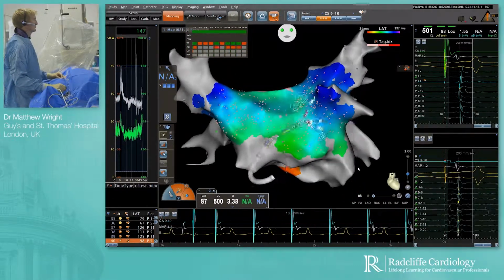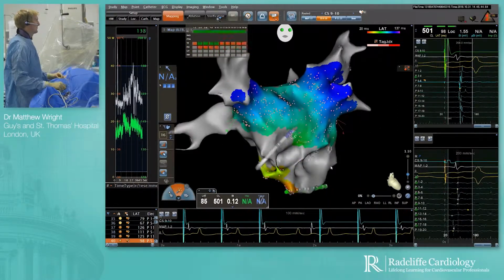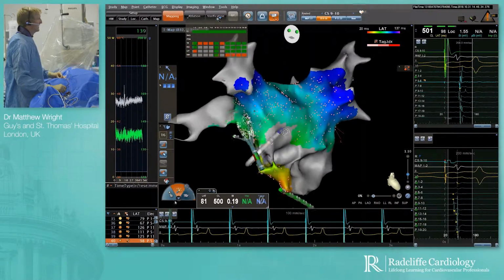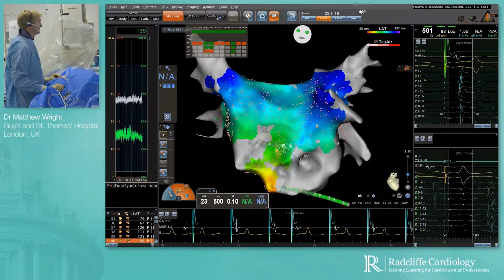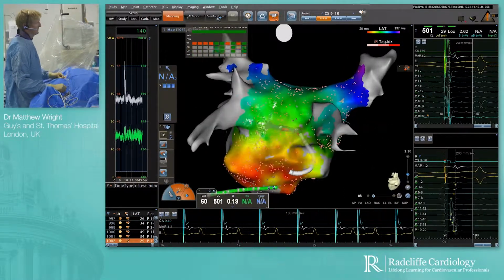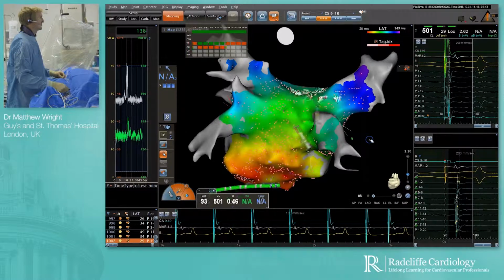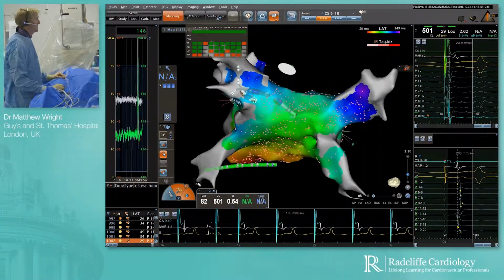we're going to work in, and also we'll have at least 1,000 individual data points within the body of the chamber of the left atrium, which is able to tell us voltage information, and therefore whether there's a lot of scar or minimal scar or no scar. Again, we can correlate this with the MRI, and unless there is a huge discrepancy, the lesion set will not change.